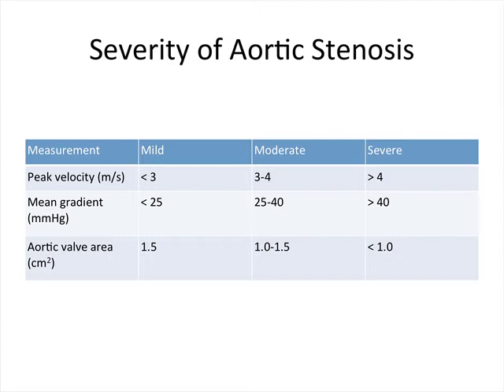It is important to remember that calculated aortic valve areas and gradients are based on hydraulic principles and the assumption that the patient has preserved left ventricular function and a good cardiac output. Patients who have impaired left ventricular function may not be able to generate this amount of pressure to overcome a severely stenotic aortic valve, yet their aortic stenosis may be severe or even critical, and thus other methods of evaluation of the valve must be used. In future podcasts, aortic stenosis will be reviewed for the patient with impaired left ventricular function.